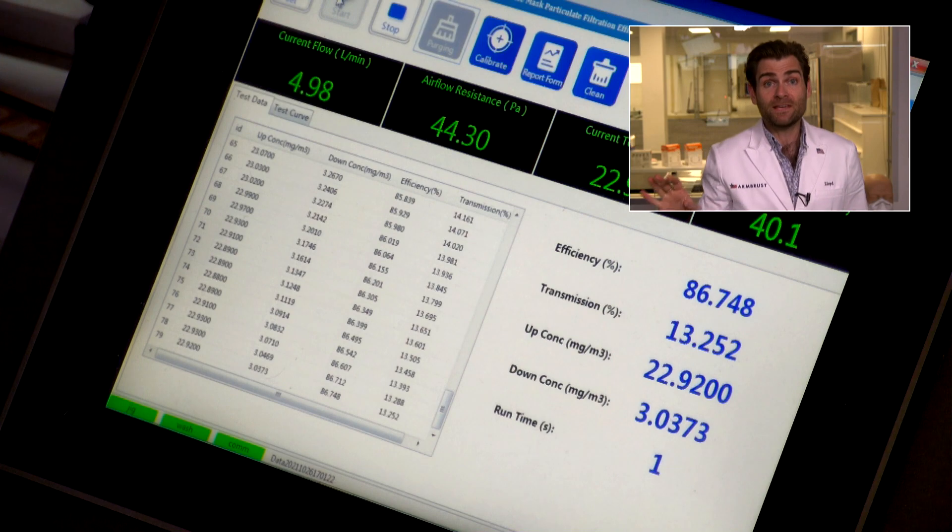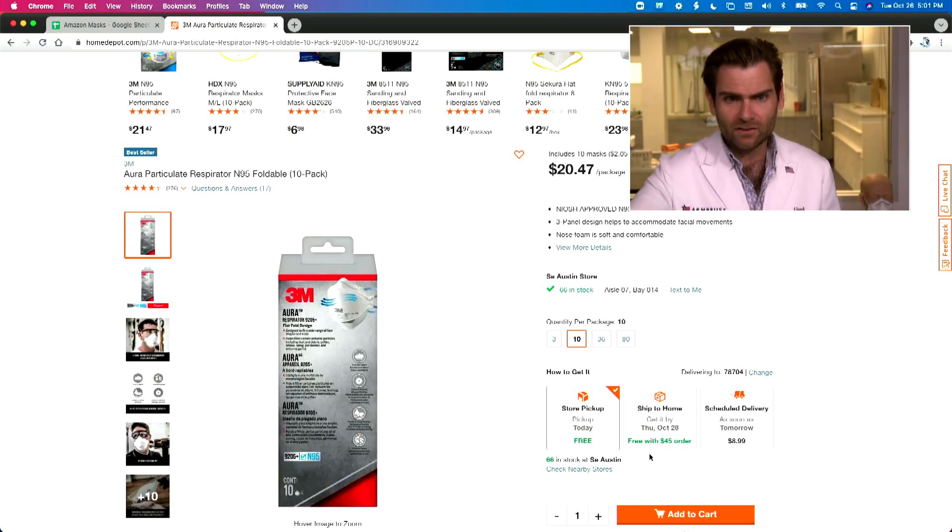We're running it through the PFE machine — the particulate filtration efficiency machine — and I'm doing the N95 test here because this is the preeminent N95. 3M is the giant that every mask manufacturer is basically copying. They invented most of this tech, and this is their top mask — the one they adapted for consumers.